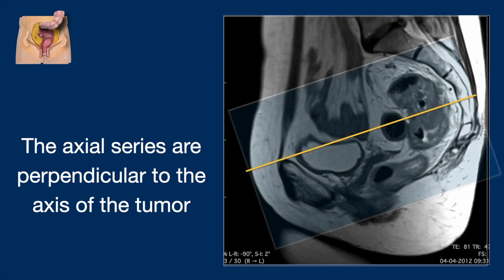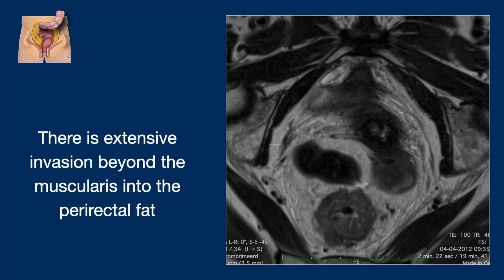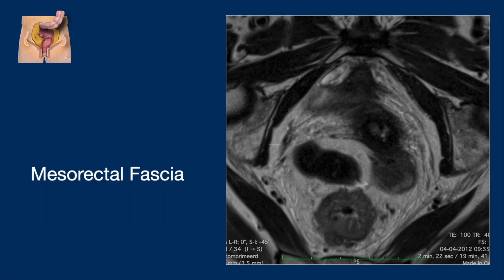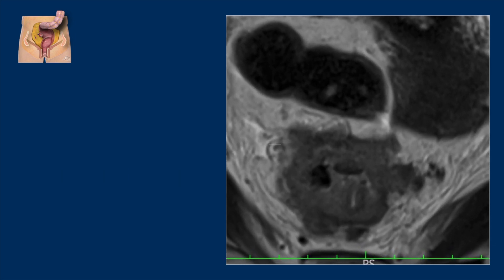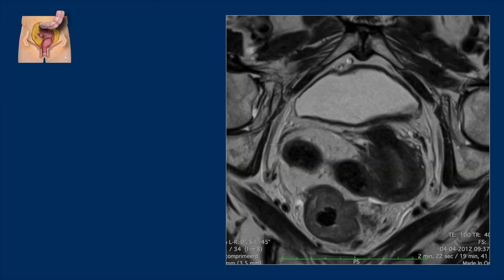The axial series are perpendicular to the axis of the tumor. There is a very irregular bowel wall, which means extensive invasion beyond the muscularis and into the perirectal fat. Regarding the mesorectal fascia on the dorsal side, we can see that the tumor is within one millimeter of the mesorectal fascia, so we must assume that the mesorectal fascia is involved. On the left side, there is obvious continuation of tumor signal into an adjacent vessel, indicative of extramural vascular invasion — and also here.